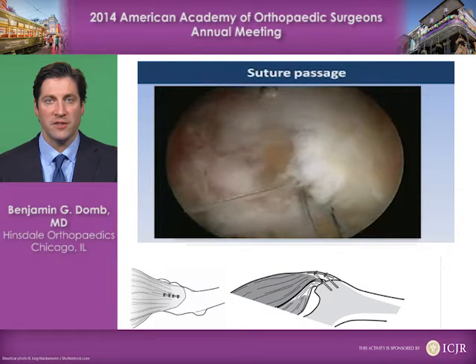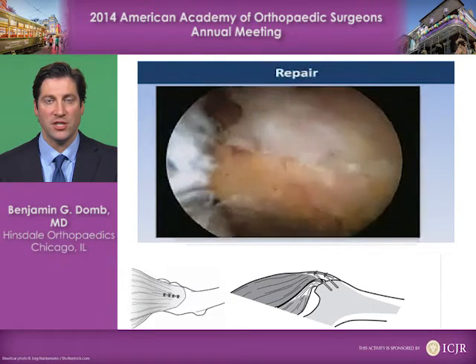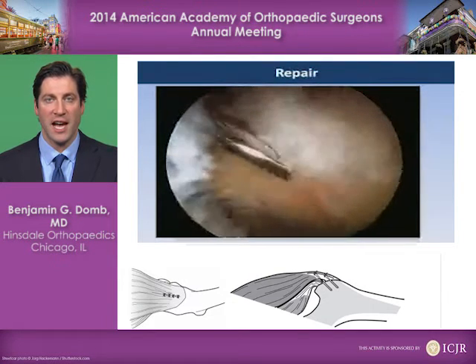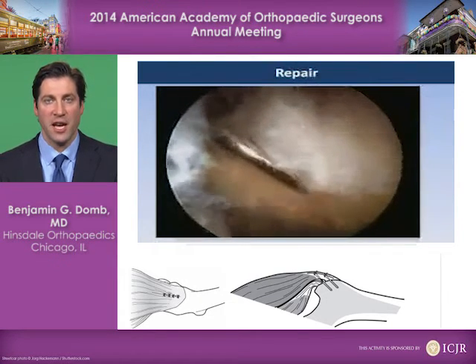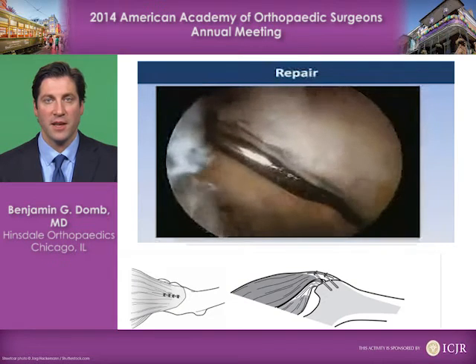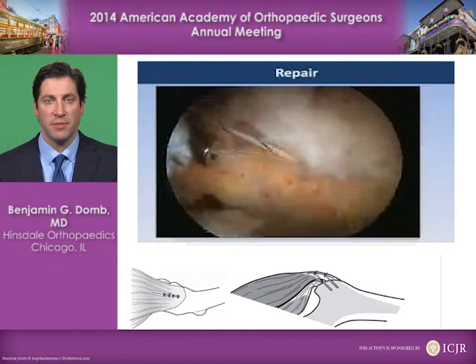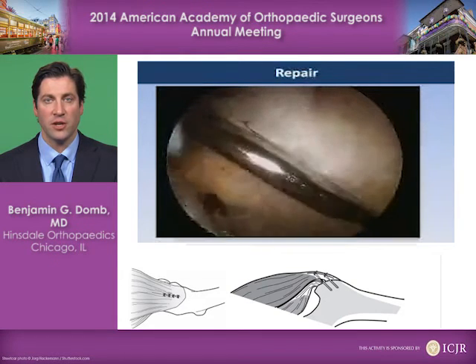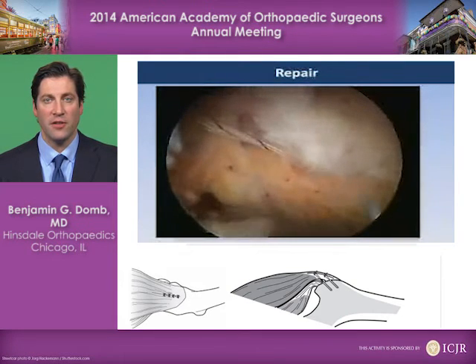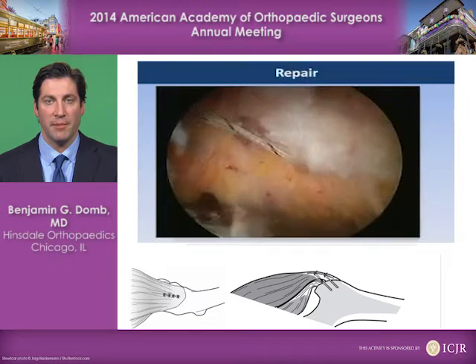After completion of the suture passage, the sutures are tied arthroscopically, and this completes the closure of the tendon over the bleeding bed of bone.